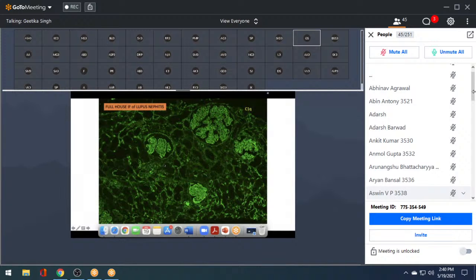So what does full house mean? Full house means that whatever panel we're doing, all 7 will be positive, right? You have seen panels of DIF till now where something was positive, something was negative. And based on the pattern of what is positive, what is negative, we are coming to a diagnosis.